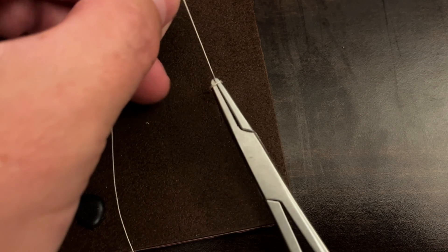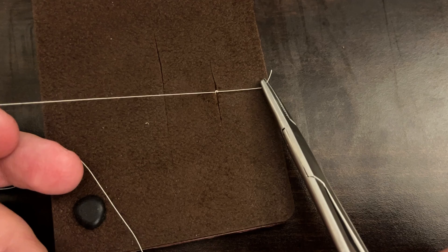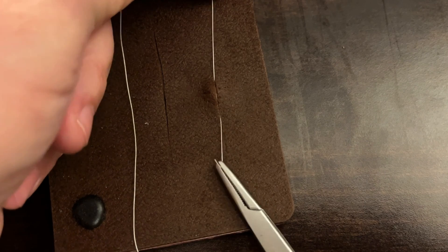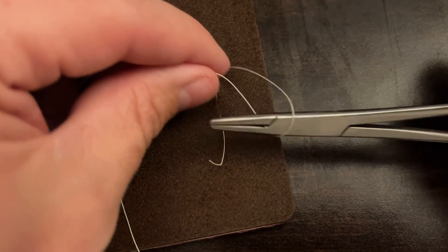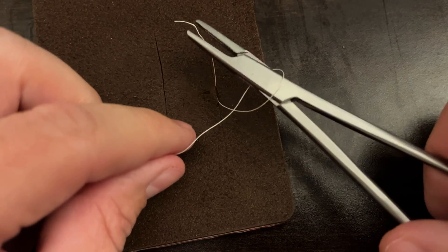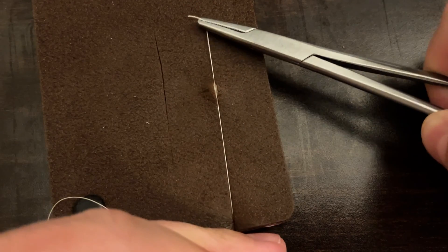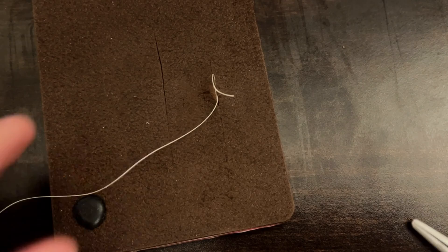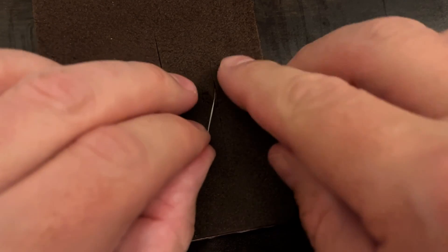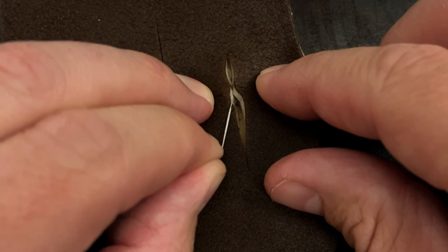As I pull this across, I don't want to be pulling perpendicular to the skin edges — it can cause microscopic damage to those skin edges. Instead, pull with the length of the incision and give it a little bit of tightness, not too tight. Then go ahead and simply instrument tie. You really don't need to do more than four throws because that will cause your knot to be too big, and there shouldn't be a lot of pressure here — four is going to be plenty. My knot is now deep, underneath the dermis.